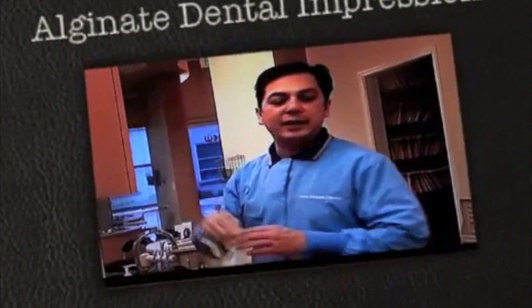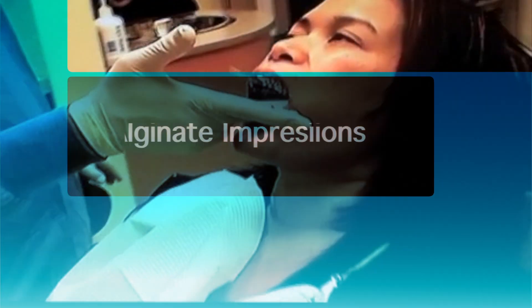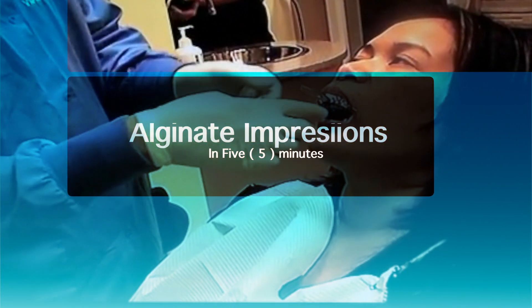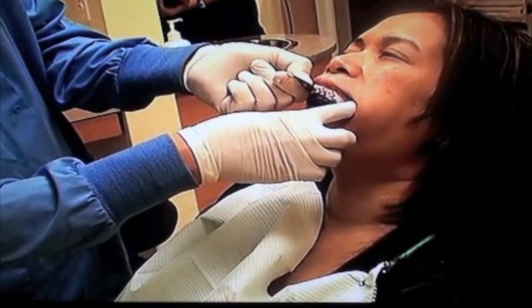What we're going to do is make an impression of the upper and the lower. The way you'll take this out would be, you'll start from the back and then disengage the tray from there.